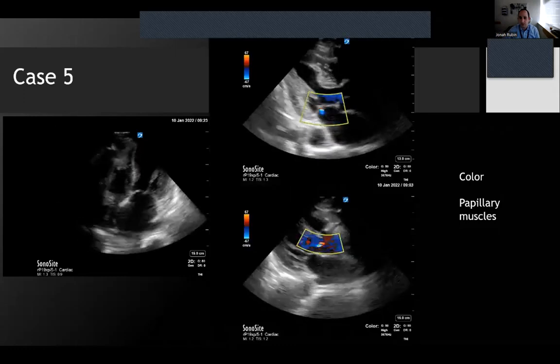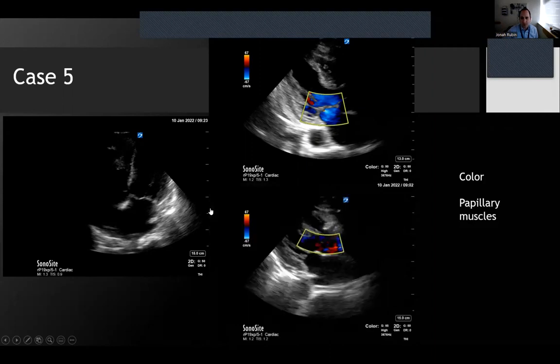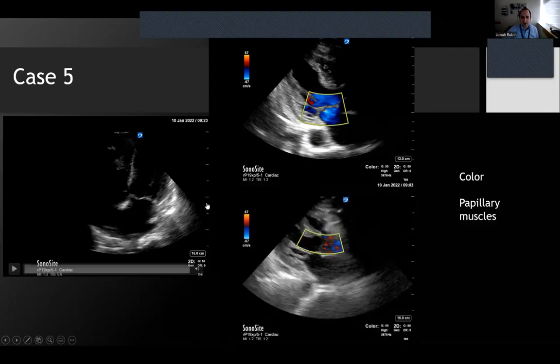Don't forget to look at your subcostal view and identify a possible pericardial effusion. Don't forget to put on your color and realize that the patient could have AI or MR or valvular pathology. Right? This is an LV systolic function focused talk, but your patient who's hemodynamically unstable, of course, can have any of several concomitant or different etiologies of their hemodynamic troubles at any given moment.